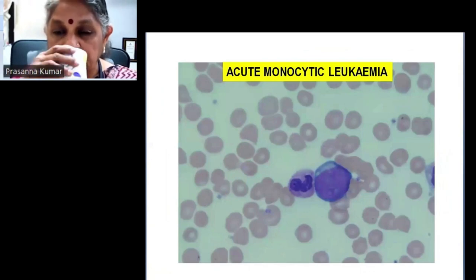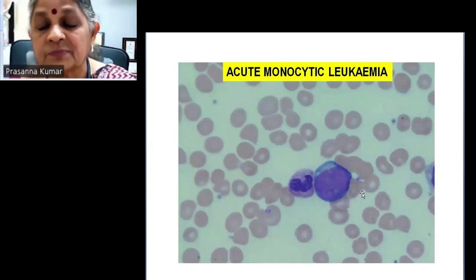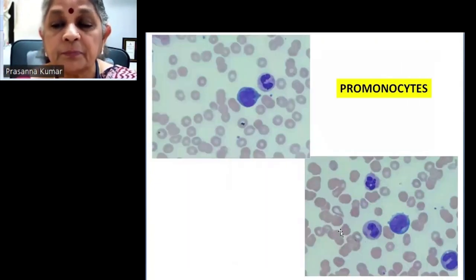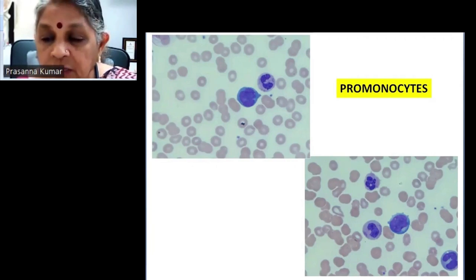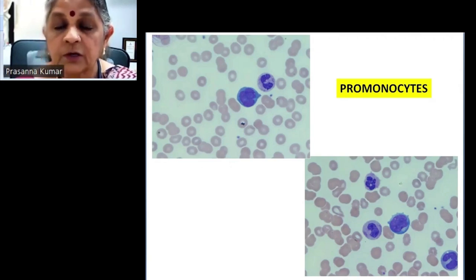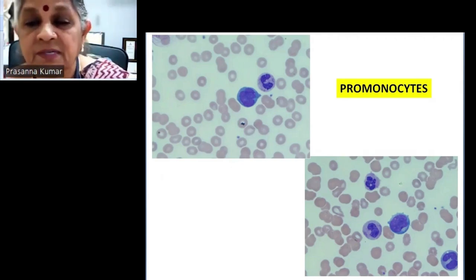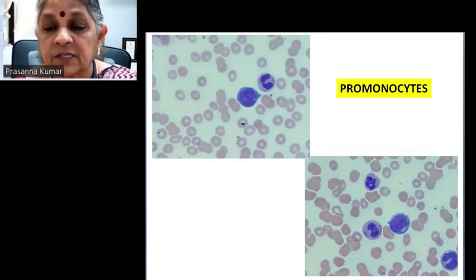Here is an acute monocytic leukemia — probably a monoblast. I want you to appreciate the nuclei and the pro-monocytes with their indentation, which the staining has very well brought out. The combination of pro-monocytes and monoblasts reached about 39 percent, and I gave it as acute myeloid leukemia — probably myelomonocytic — pending flow cytometry results.